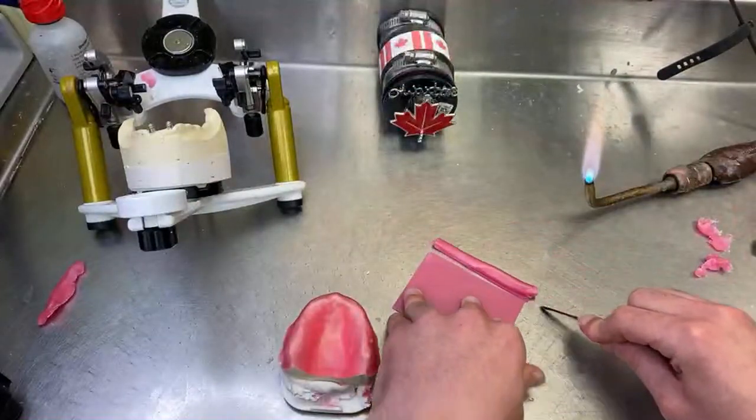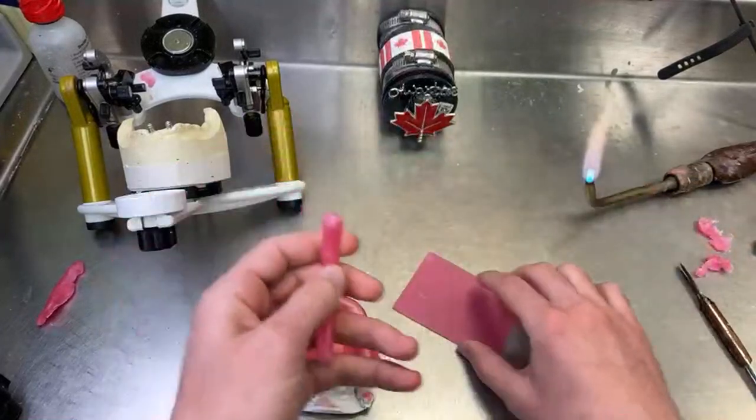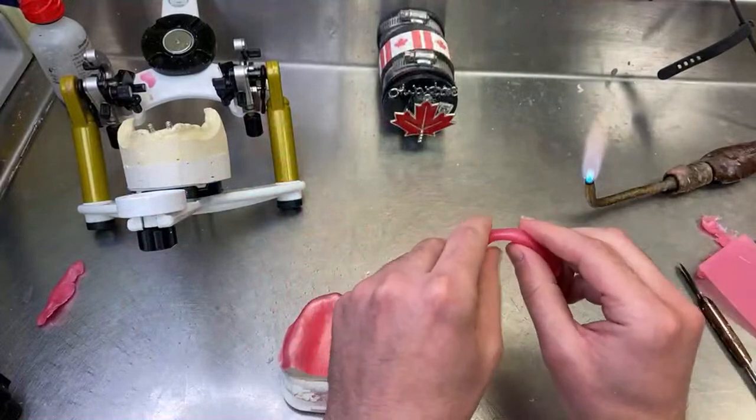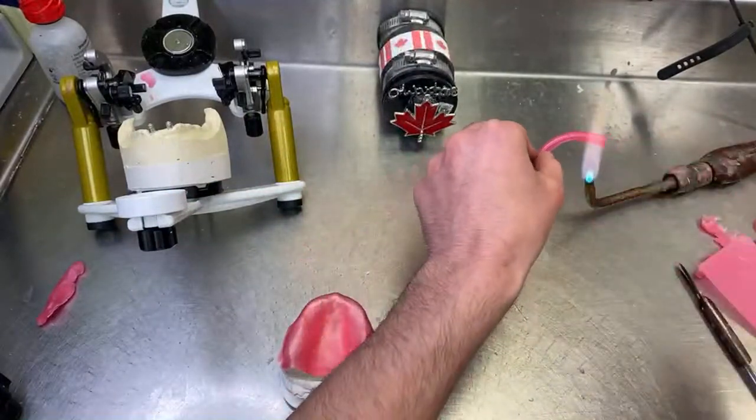So these wax rims are not the actual wax rims that you do in school, where you would look for all the dimensions and everything. This is just so I can put the teeth on.